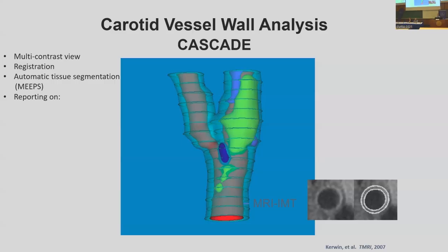In this case, I think MRI imaging played a key role of its development, especially for the carotids, because of this so-called importance of intraplaque hemorrhage. You have heard many talks in recent days about this is a so-called high-risk factor and so on. But this entire thing is because of MR's ability to identify intraplaque hemorrhage in the first place. We started to realize this is an important thing happening in atherosclerosis, especially in the carotids, and we should actually be having better understanding of it.